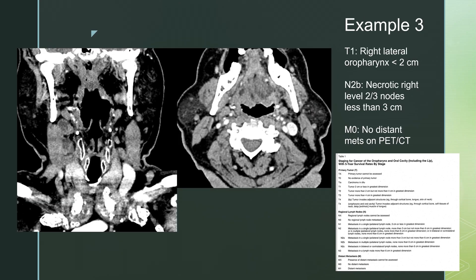For case three, we have a mass involving the lateral wall of the right oropharynx. It is easier to see on the coronal view — you can see this thickening along the lateral wall, as opposed to the nice smooth mucosa on the left side. Here's the tonsillar pillar above it. On the coronal view, you can also see some adjacent necrotic lymph nodes at level two down towards level three. On the axial view, you can see that subtle thickening of the lateral wall of the oropharynx.